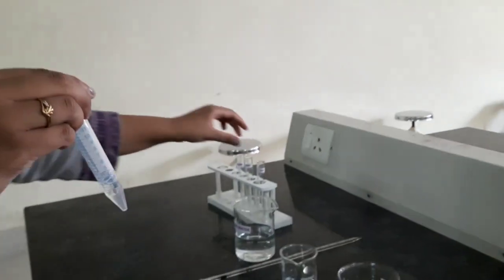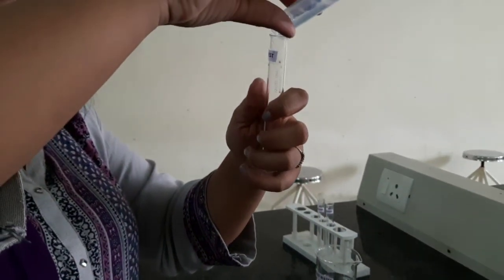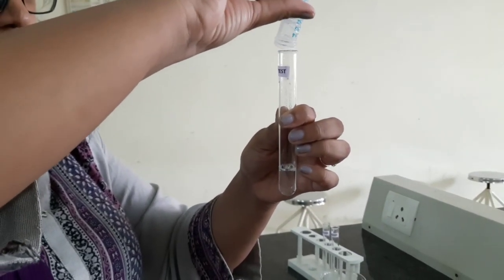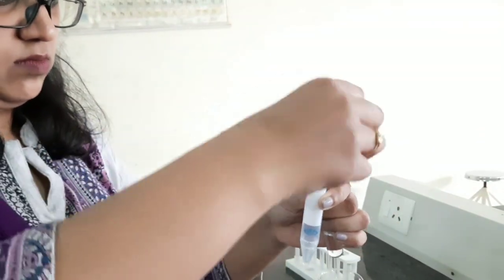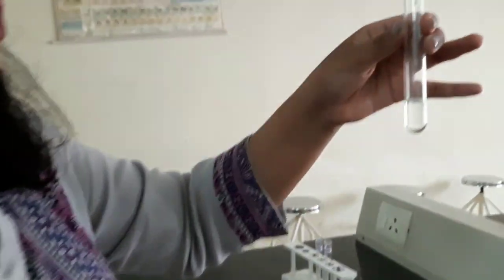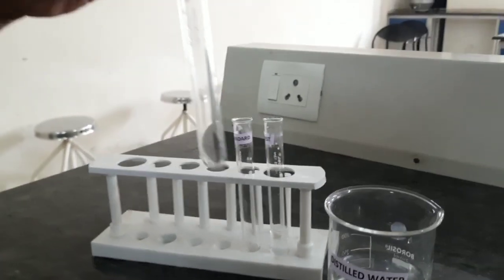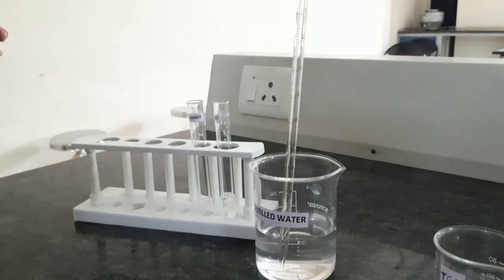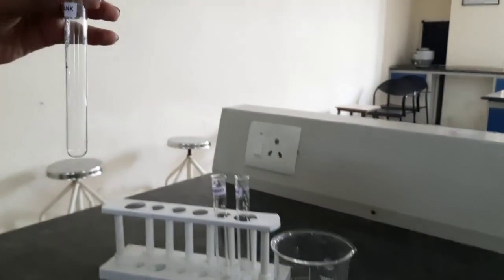Now we have to transfer the test sample to a test tube. We are going to transfer it into a test tube. So the volume here is 3 ml. So this is our test sample. Now we are going to take blank tube. In the blank tube we should take 3 ml of distilled water. 3 ml of distilled water is going to act as our blank.